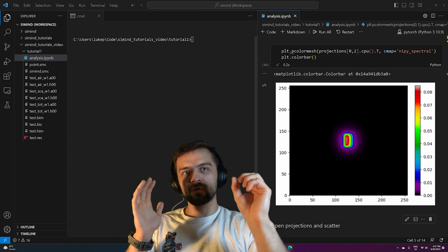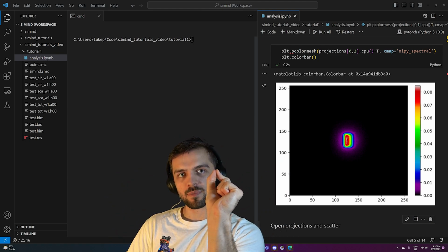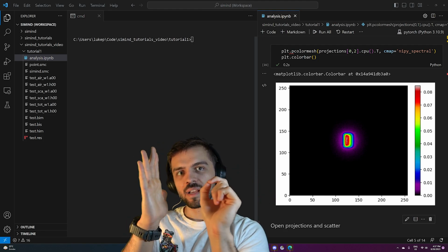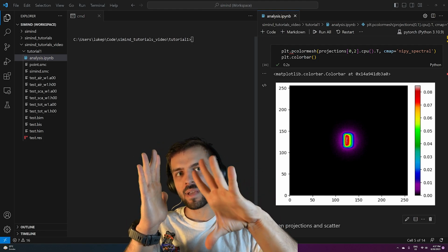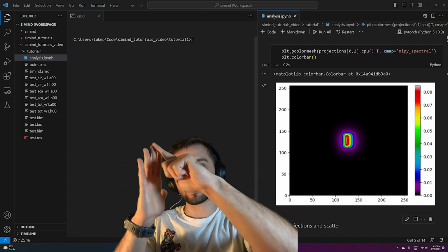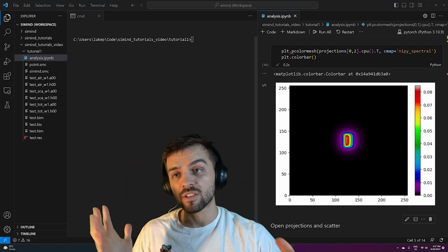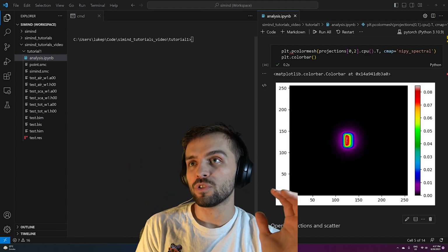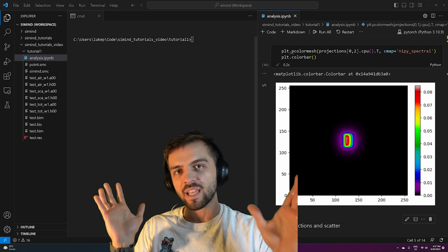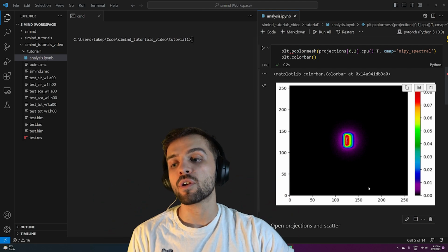So the idea there is that if you have photons at one point in space here, and the detector, they're only going to hit the detector right here, even though the source is emitting photons isotropically. So any photon that gets emitted and comes like this, hitting the scanner, isn't going to be detected. Now, you might think that that's foolproof and that there's no way that photons traveling anywhere else will get detected. But there's something known as scatter.